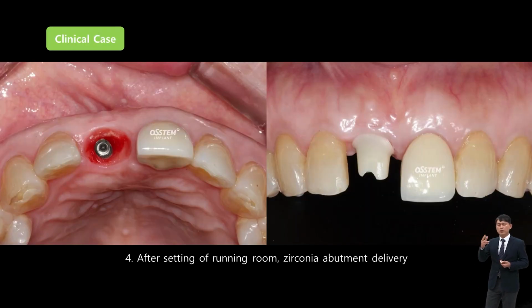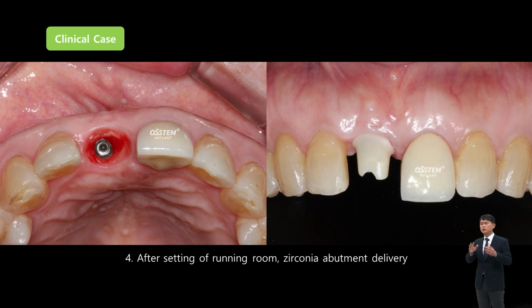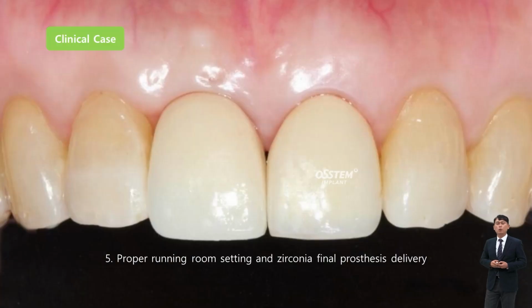An individualized pickup impression coping is fabricated to take the impression immediately, and the abutment with the same volume and curvature as the running room is fabricated and mounted. So in that way, a final prosthesis can be fabricated that can last long.